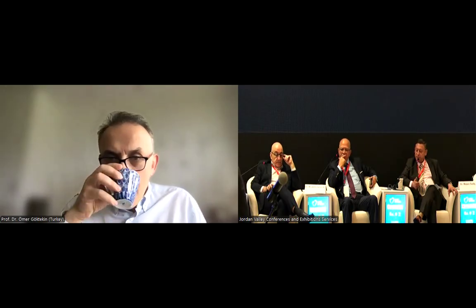Dr. Ayman Hamdan, do you want to? Thank you, Dr. Ömer. I don't know if the jury is out now. We have a meta-analysis of more than 800 patients that showed comparable MACE between DCB and stenting. We know that the coronaries like to twist and bend, and DCB leaves no stent behind, meaning we will not have in-stent restenosis.